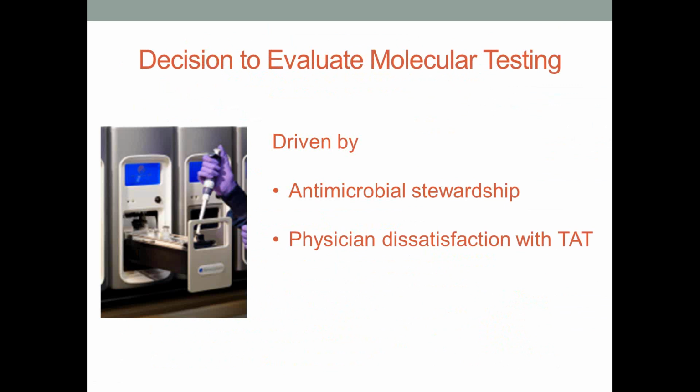And so this was a win-win of offering better treatment and potentially decreasing cost of overall care, though we still need better data to show that that's really what we're able to do when we give these faster answers. And then we saw how that could also be extended to respiratory viral testing. If we could prevent that additional treatment and diagnostic testing by quickly knowing what the respiratory infection was, that should also aid in our antibiotic stewardship efforts.